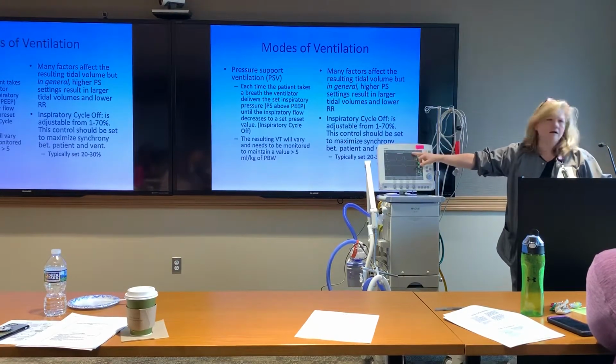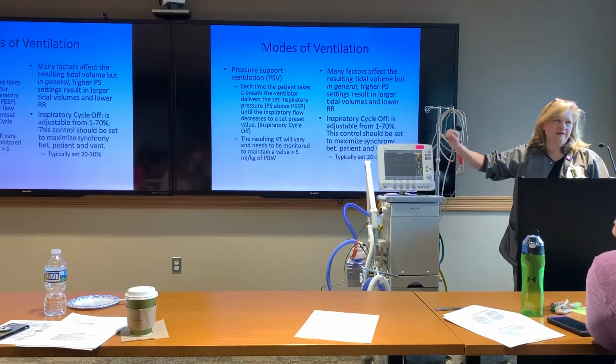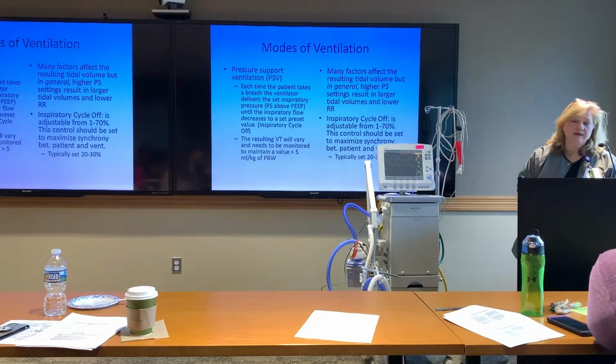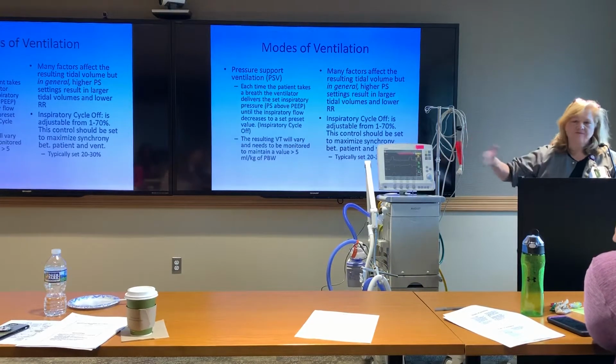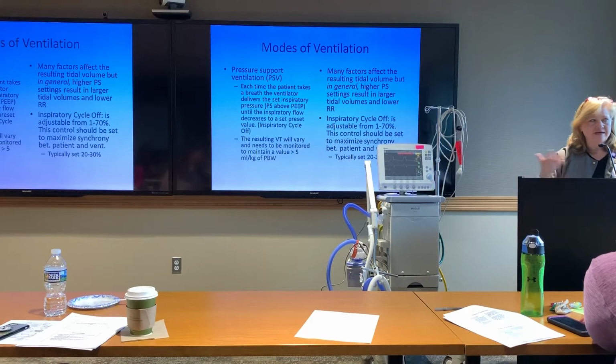I've come in and seen alarm silence, no patient effort. Alarm silence, no patient effort. And then alarms again, no patient effort. It'll be silent for 2 minutes. If you don't fix it, it's going to alarm again in 2 minutes. But if you don't fix it, you just come in and silence it every 2 minutes, nothing's happened. The patient is still apneic, right? So this can happen, and it has happened.